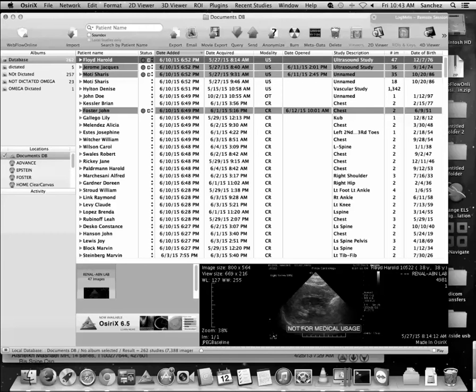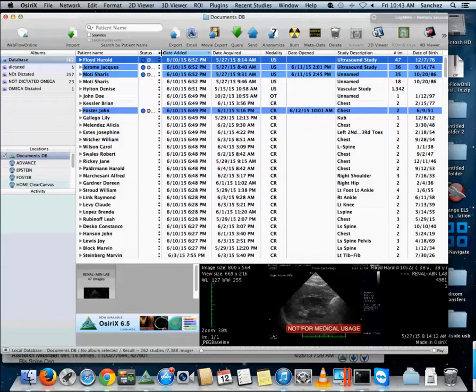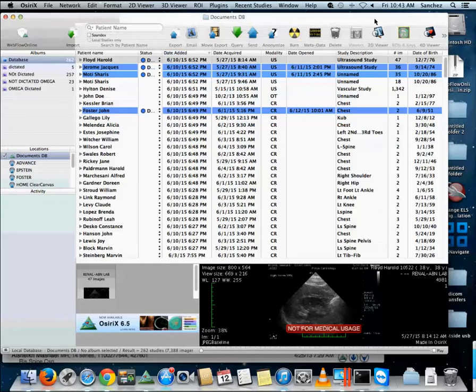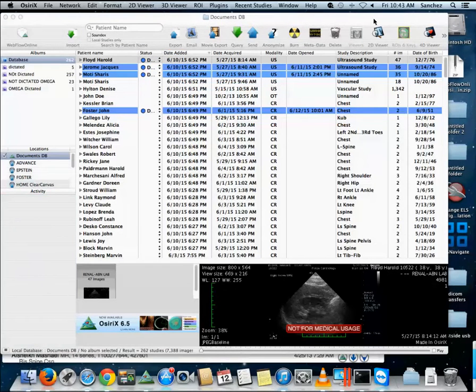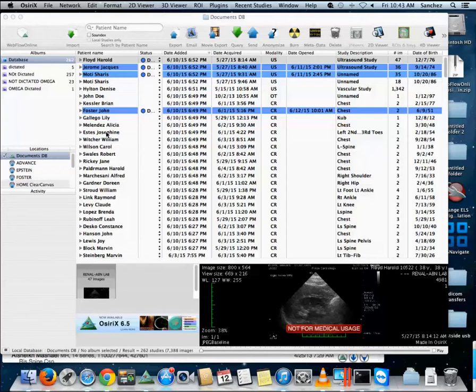We're going to discuss the Osirix web application and the custom programming I'm interested in. What we have here is the Osirix desktop application that runs on a Macintosh. I have created this plug-in here that you see, the top left icon, and what this does is it opens the study.